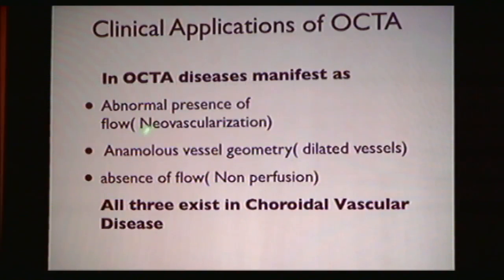We can see neovascularization, we can see dilated vessels, we can see non-perfusion, and all of them exist in choroidal vascular disease.